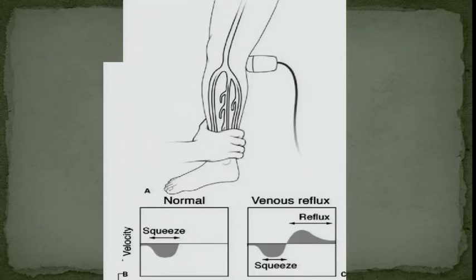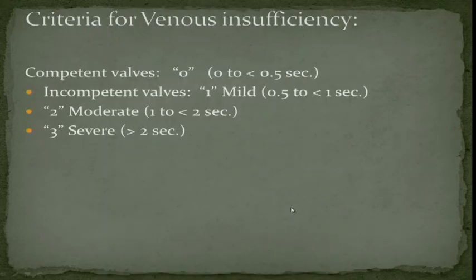You have all seen venous reflux exams with me. We do 1 or 2 a day. And we know that sometimes the changes are subtle, but they can be appreciated if you're looking for minimal flow above the baseline. Interpretation is actually very easy. Performing is very difficult. You see what I'm saying? Interpretation: oh yes, there is reflux. Oh, there's no flow above the baseline, there's no reflux. All right.